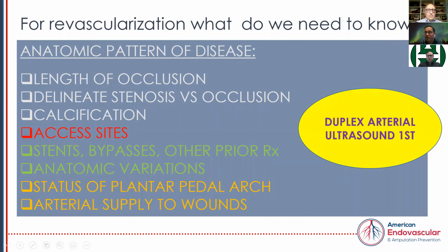So what fulfills this best for us? Predominantly duplex ultrasound. I think Dr. Shams alluded to this earlier. And we all have in our facilities dedicated lab techs with whom we work, because an average lab tech, if you send them out somewhere, will also give you somewhat challenging data.